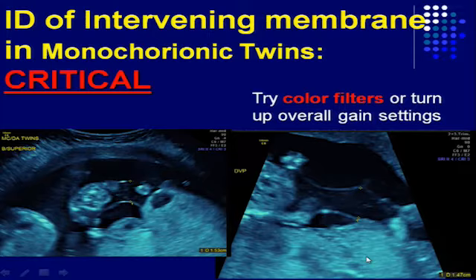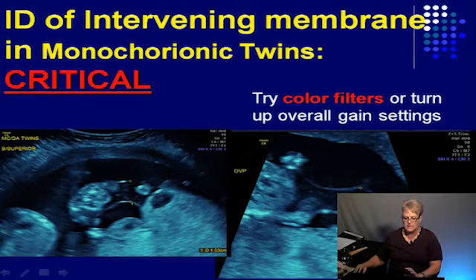And the way to look is don't look around the head or the tummy trying to see where the membrane is. Look for the arms and the legs because that's what's moving. If the baby's moving at all, it's the arms and the legs. And that's where you see the membrane being distended as the baby's moving the arms and the legs.